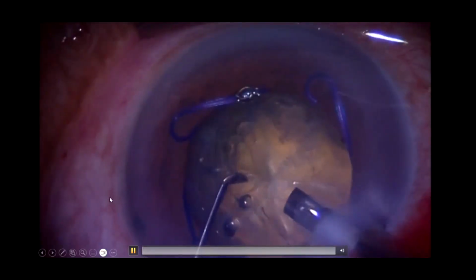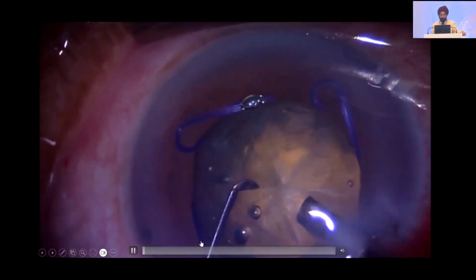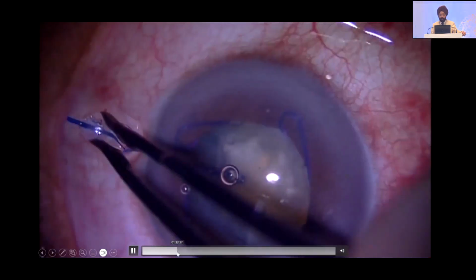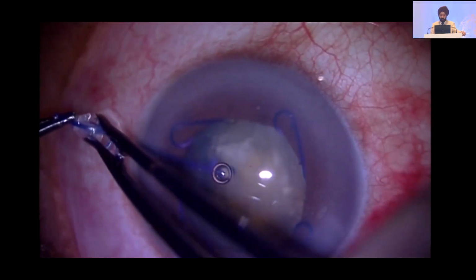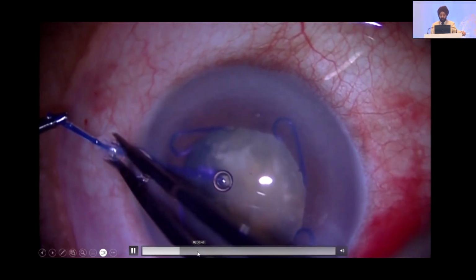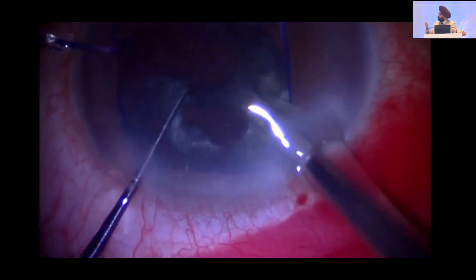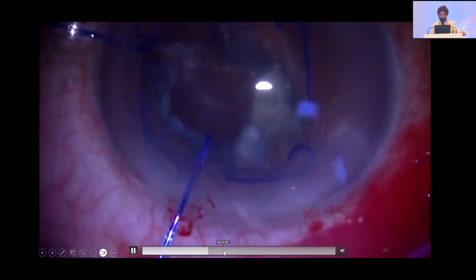Well, this is after the femto, because you have been able to do the capsular access well. The ring is in place. You can see that there is mobility of the nucleus. So what is being used is the hooks. Ideally, capsular hooks should be used, but these are the iris hooks which can still stabilize. And once you have stabilized, so you have a Malyugin ring, you have capsular hooks, and you can work and get away the pre-chopped nucleus, as you can see.